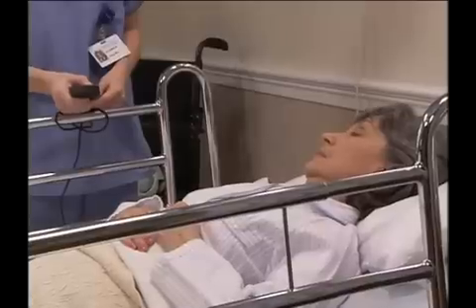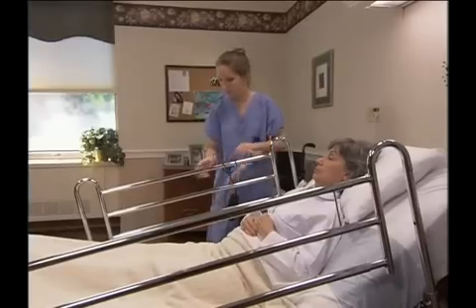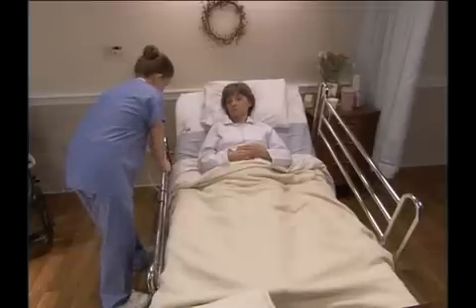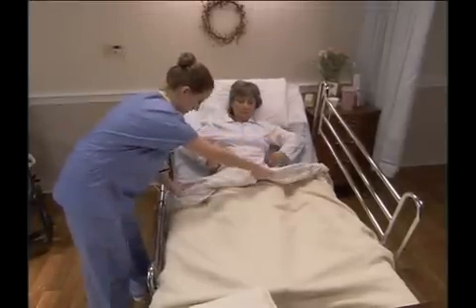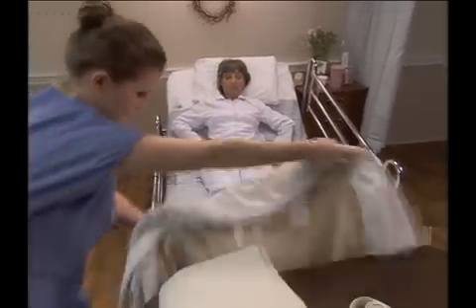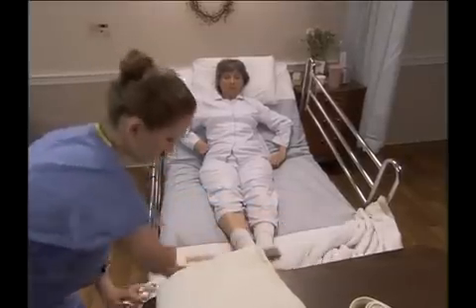Raise the head of the bed as tolerated. Feeling dizzy at all? No. Okay. Then make sure the bed's wheels are locked for safety. Next, lower the side rail on the side of the bed next to the person's strong side. This is the side you'll be working from. Leave the opposite rail up. Fan fold the top linens to the foot of the bed.